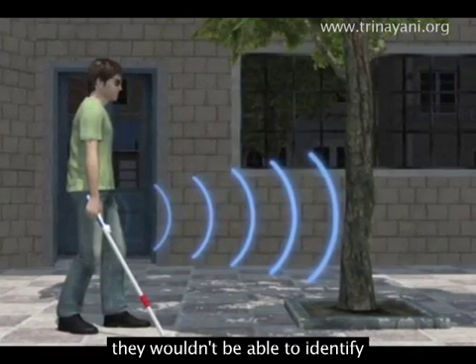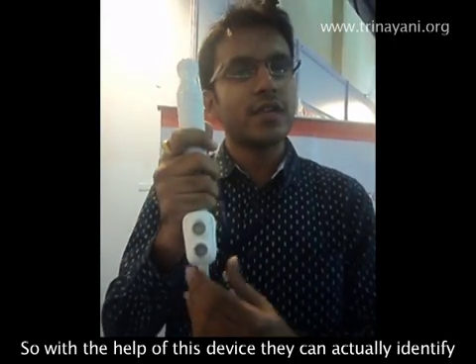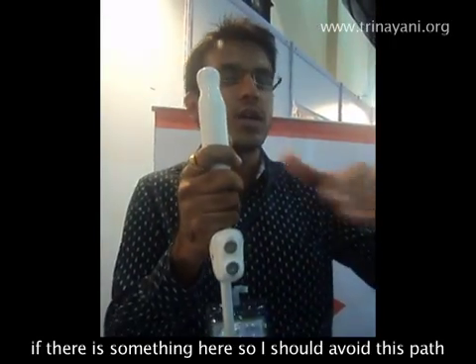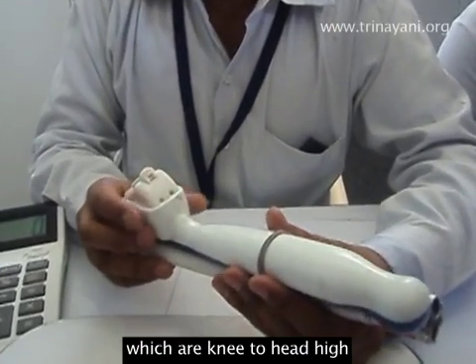For example, protruding branches — they won't be able to identify whether there is a branch ahead or not. So with the help of this device, they can actually identify that something is there and know they should avoid that path. It identifies any obstacles ahead which are knee to head high.